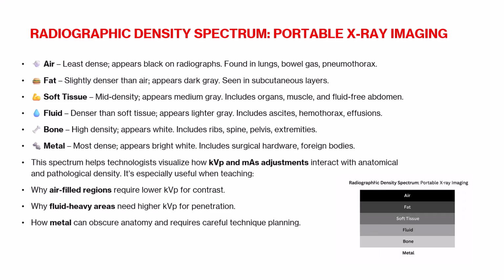The core concept: for extremities less than 15 centimeters, measured with calipers or estimated visually, scatter is minimal and contrast is naturally high. Basic manual technique, typically around 60 to 70 kVp and 2 to 6 mAs, depending on the part thickness and projection, delivers diagnostic quality without the need for grid compensation.